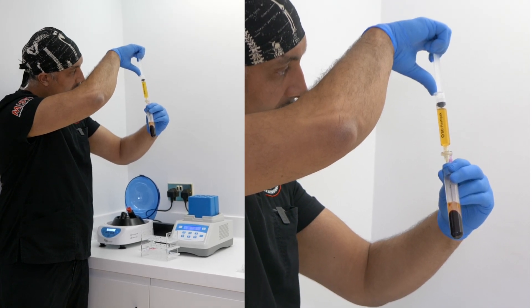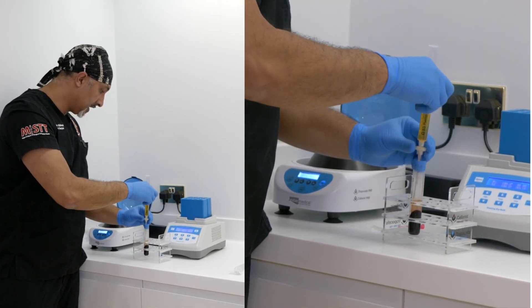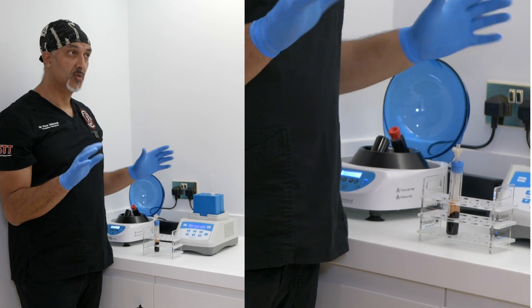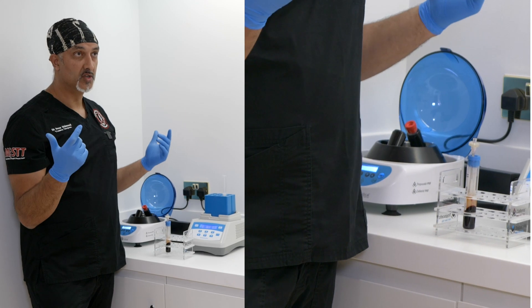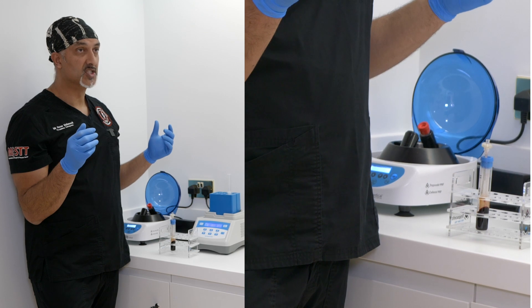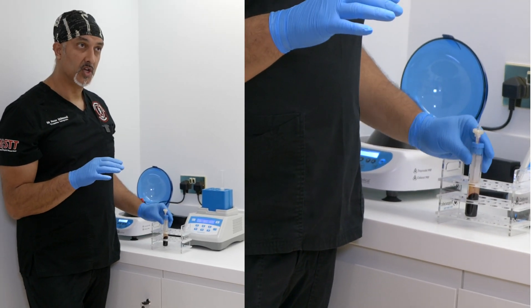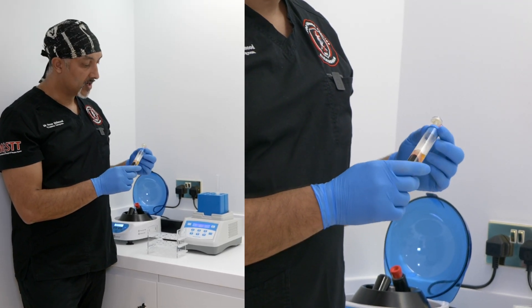I've got 10ml there now — I'm happy with that. You'll notice the lovely gold plasma with no contamination of red cells. Red cells create apoptosis — cell death — they create inflammation, and there's a small chance that as red cells break down you can create hemosiderin staining, so you can actually generate pigmentation in your patient which can take quite a long time and re-treatment to get rid of. You don't want red cells in if you can help it, because they have nothing beneficial for skin.